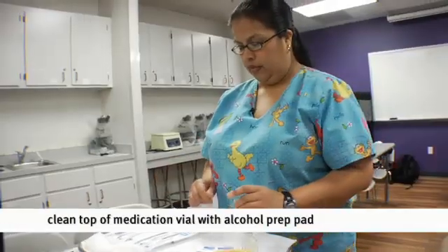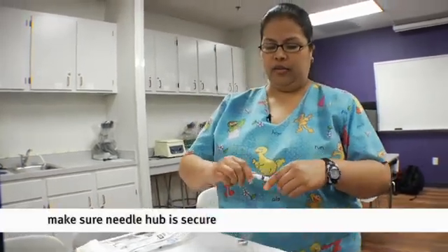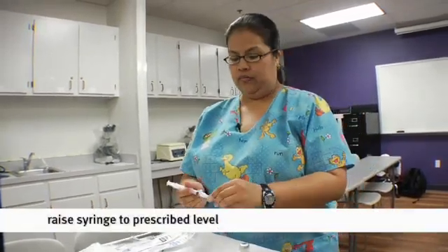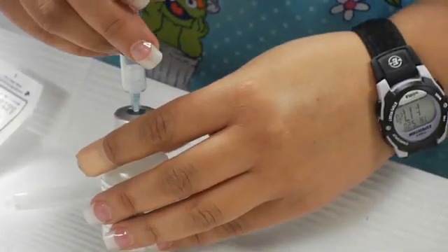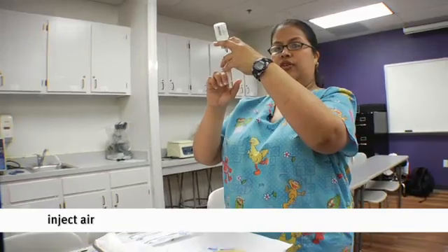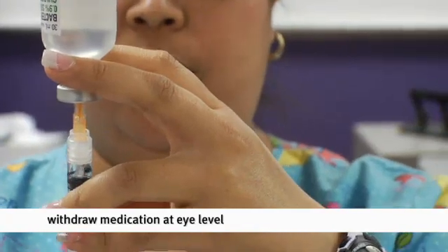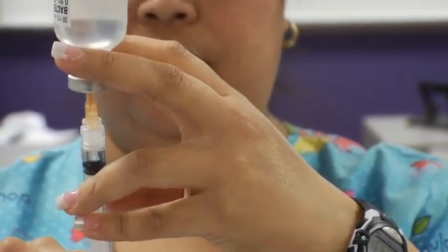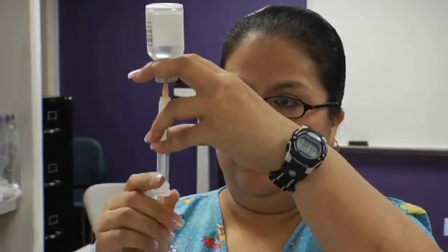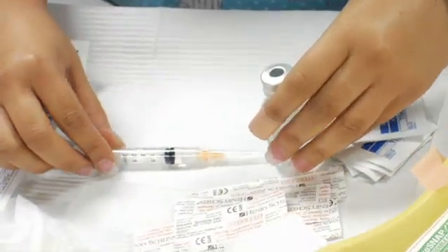Grab your alcohol prep and wipe the vial. Grab your needle and make sure the hub and the needle are screwed in correctly. We're going to draw 0.5. Come up to eye level, inject your air — but don't push it all the way in, especially if they're safety-locked, because you'll lock the whole needle. Withdraw at eye level by pulling back on the plunger to 0.5, remove any air bubbles, then withdraw. Use the one-scoop method to prevent any needle-stick injury.